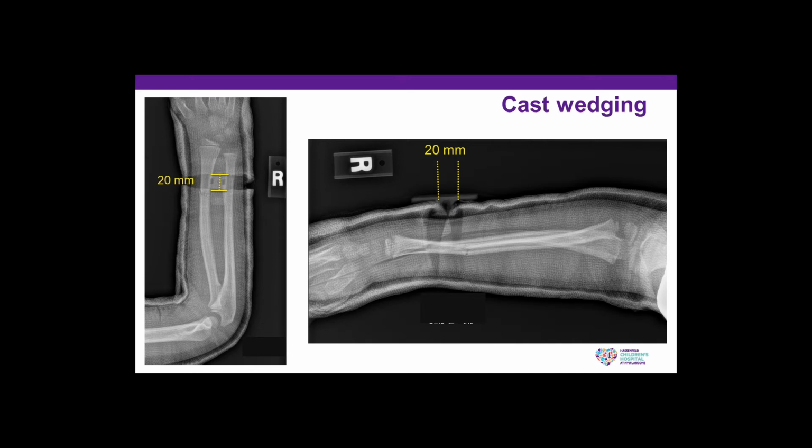In this case, the fracture had a volar apex, and there was minimal rotational deformity or translation. Therefore, a wedge was cut on the dorsal aspect of the arm. By placing the wedge opposite to the apex of the fracture, an opening wedge acts as a fulcrum. By exerting a tensional force on the concave side of the forearm, the deforming forces of the fracture are countered, and the concavity is progressively straightened, causing the fracture to align as well.